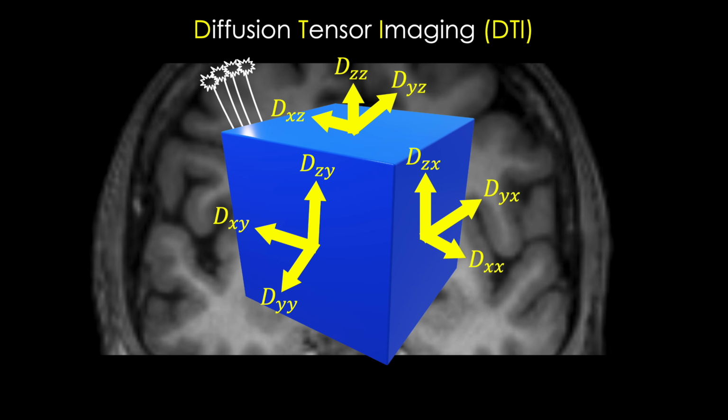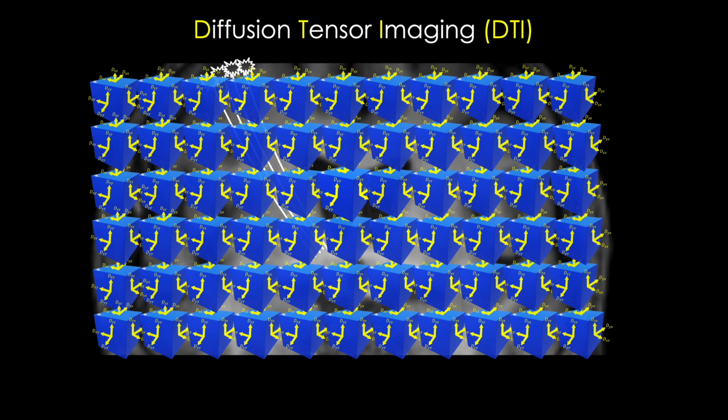So we have calculated these diffusion tensor values for not just one cube of matter, represented by the voxel of our image, but for every single voxel of the image. And we're going to need some sort of algorithm examining how the diffusion in each voxel relates to the voxels adjacent to it. That's beyond the scope of this lecture, but just know there are algorithms with names such as fact that do this.